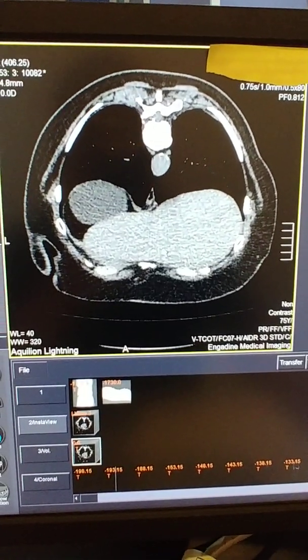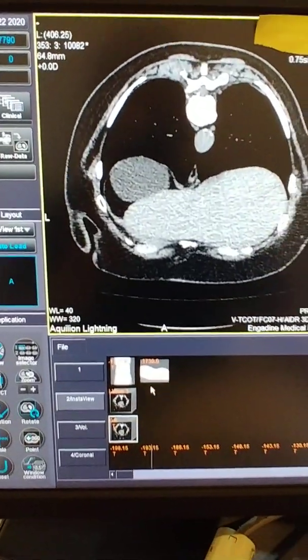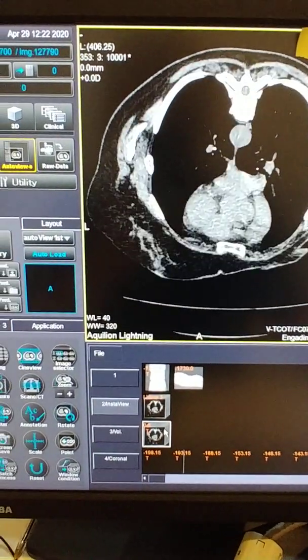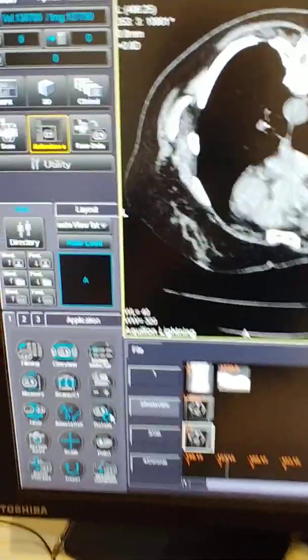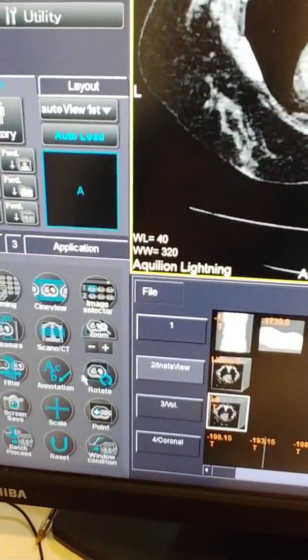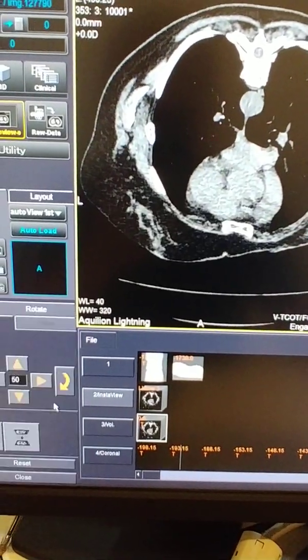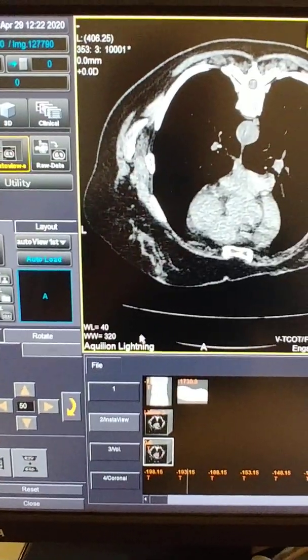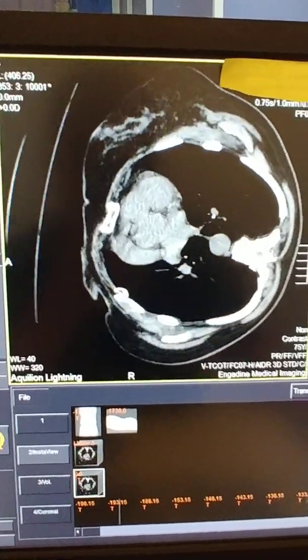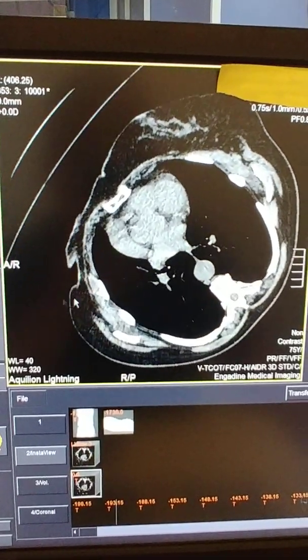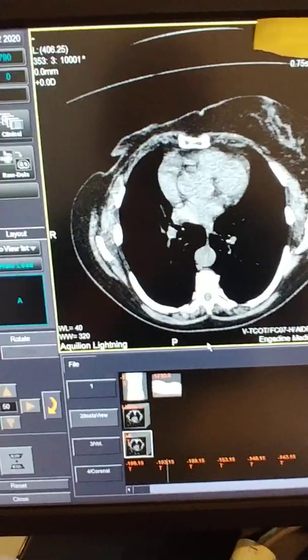In order to do that, there were a few tips received from the Toshiba team. First, we need to click on the volume, then click on rotate — which is next to the annotation button in the left corner toolbar — and simply turn the image upside down into a supine position.